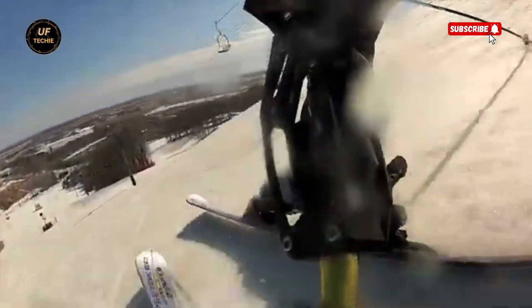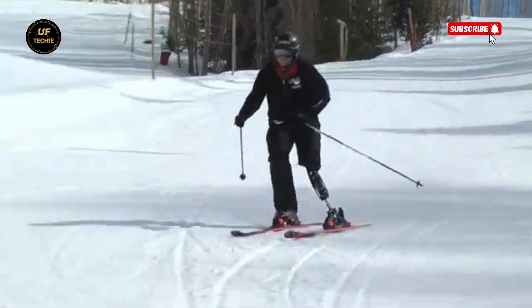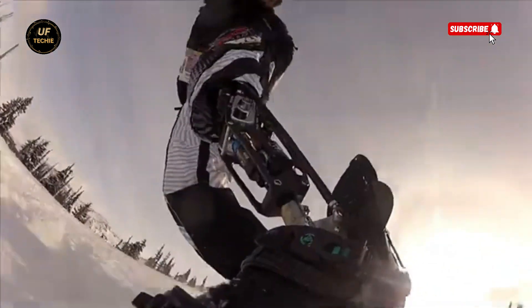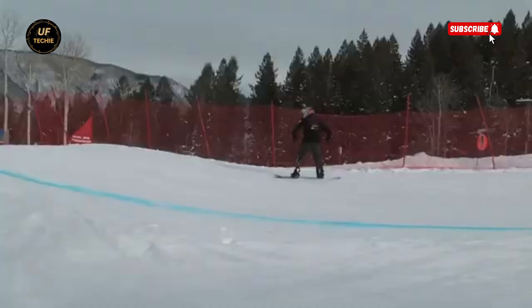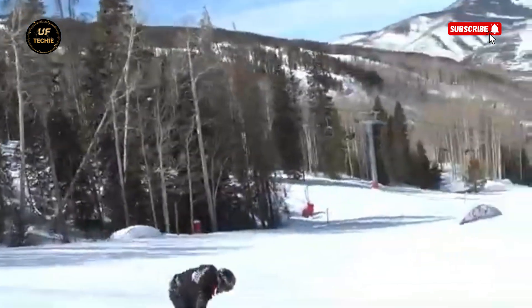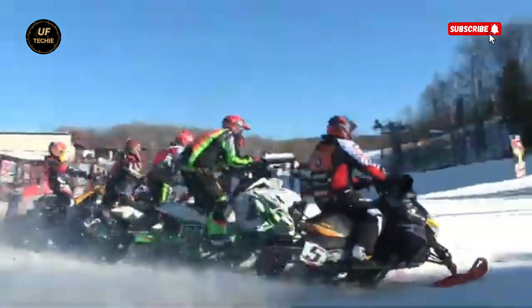The Moto Knee is unlike any prosthetic you've seen. Built with performance in mind, it features adjustable shocks, air springs, and a unique linkage system that mimics natural leg movement with incredible accuracy. It looks like a piece of racing hardware, and it performs like one too. The system offers a dynamic, responsive feel that gives users control, track balance, and agility during even the most intense physical activity.